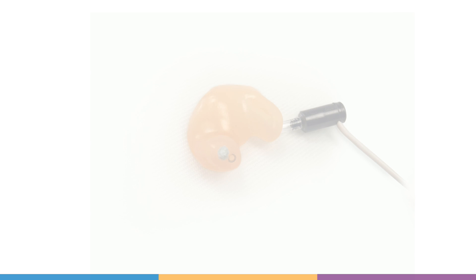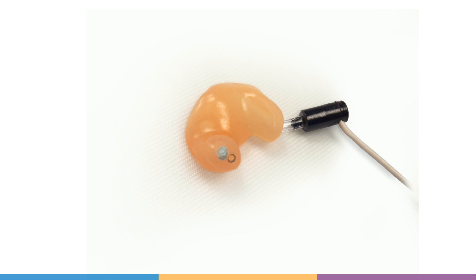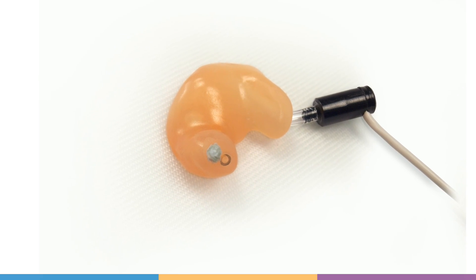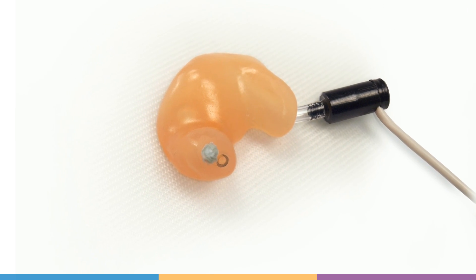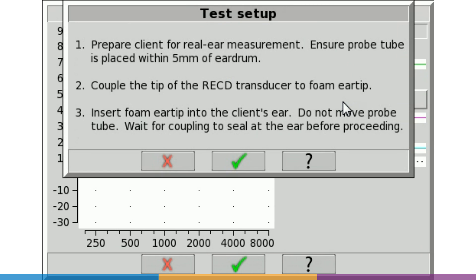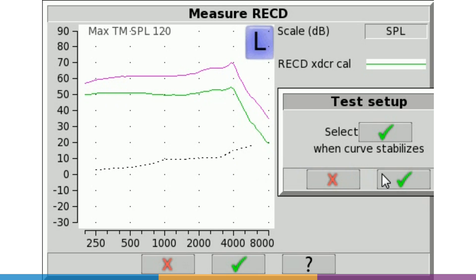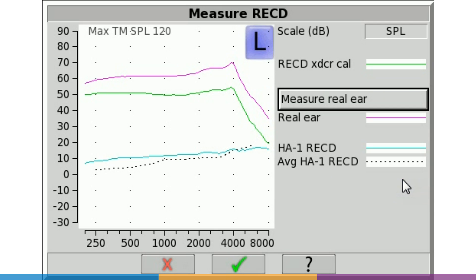When using an ear mold for the RECD measurement, be sure to block vents at the medial end. Lubrication can be used to aid in a proper seal. Select Measure Real Ear. On screen, the real ear measurement will be shown as a magenta curve. When that stabilizes, it is captured and stored, and the RECD or WRECD will be automatically generated as a blue curve.